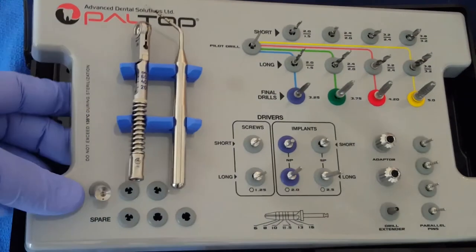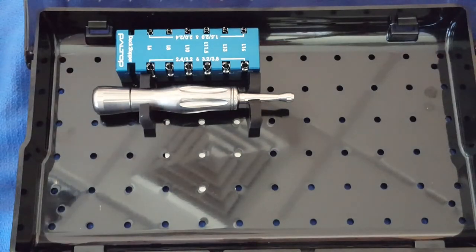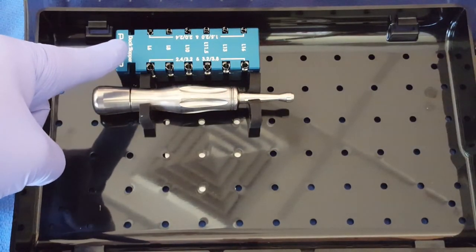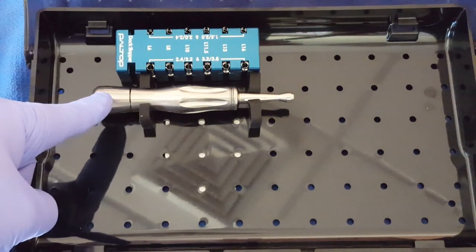Under the tray insert, there are two additional items. There is a drill stopper kit as well as a hand driver.